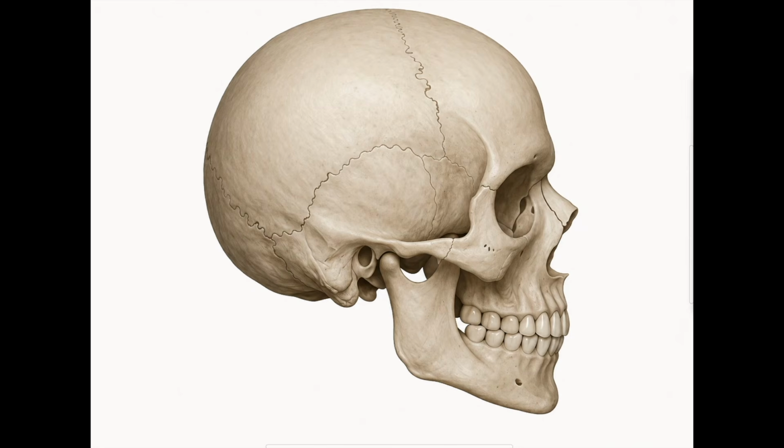Now that you can see the round window membrane and trust that you can place the cochlear implant, you can open the device and start creating a pocket for it. Let's draw out where we're trying to put this. You're drilling your mastoidectomy cavity here, and you want the implant to go roughly at a 45-degree angle, superior-posterior, to your cavity, with the electrode ultimately curling into the cochlea.